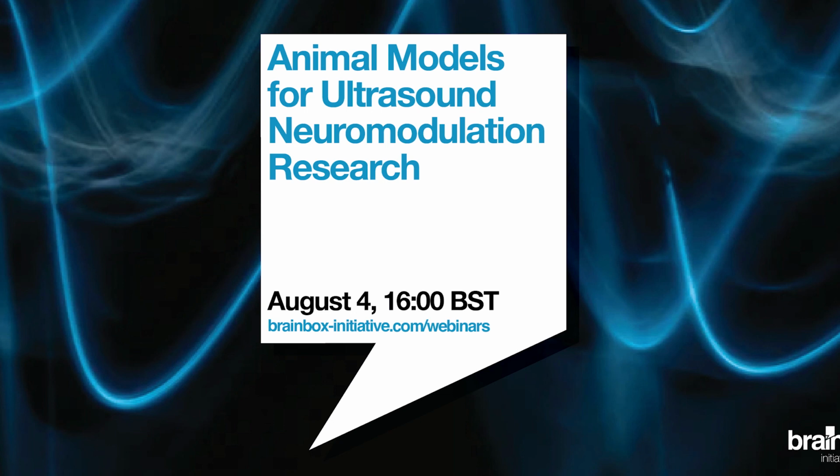I think the question was actually about human research, which is ongoing and really growing rapidly. Honestly, I think BrainBox is going to have a huge part to play in that. They've built an IDE, an investigational device exemption human device, that can use neuronavigation, and you can hold it up to your skull and have an idea of where you're targeting.